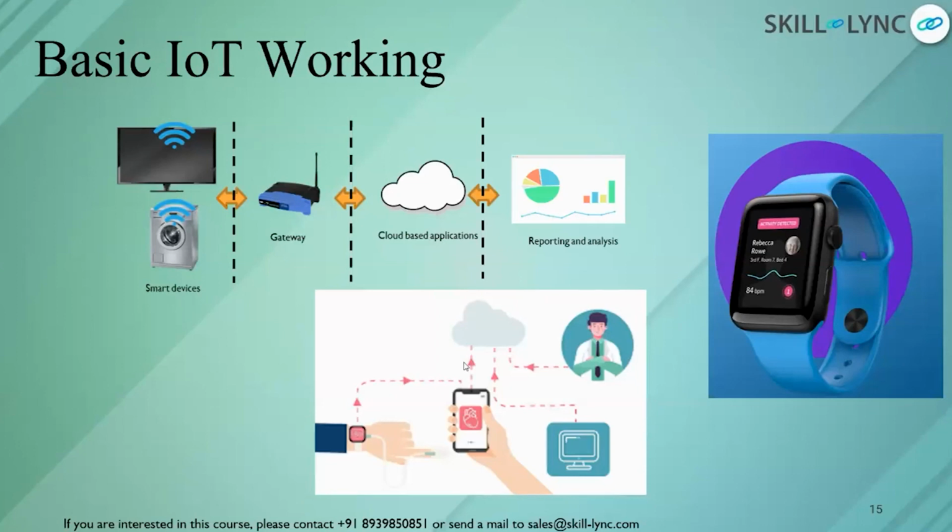It decreases the resources needed. Say I have a smart hospital application where I have 15 patients with glucose issues or diabetes. Think I'm using a non-invasive continuous glucose monitoring device, like your smartwatch. It is going to monitor the glucose. Think if I have 50 patients in my hands and I can monitor them on a daily basis, right? With minimal resources, I can actually do it.